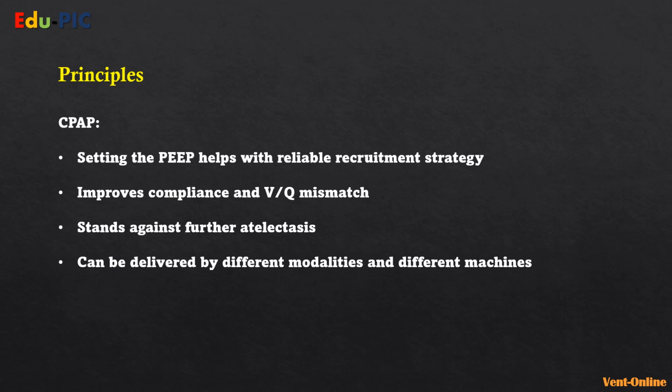So generally, CPAP goes with principles that setting the PEEP helps with reliable recruitment strategy. It improves the compliance and the VQ mismatch, or the internal shunting. Stands against further atelectasis, so it is a protective measure that you don't get further atelectasis, and can be delivered by different modalities and different machines, which makes it more of a pragmatic approach.